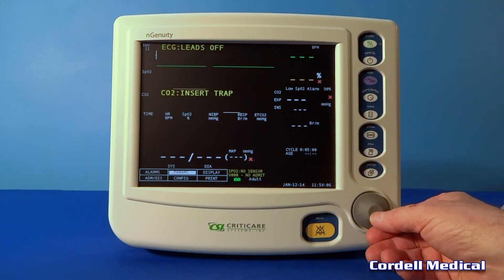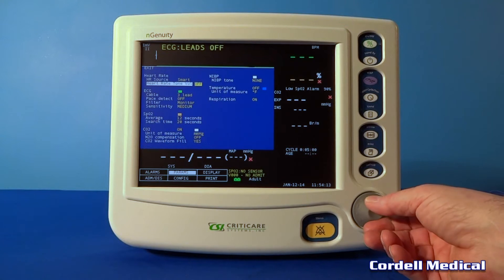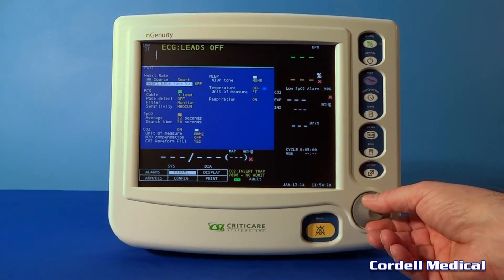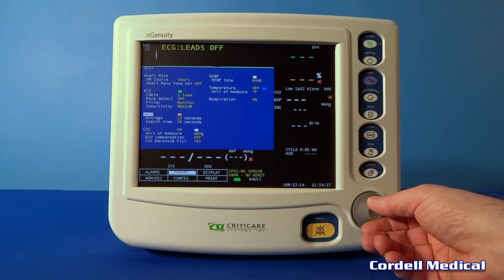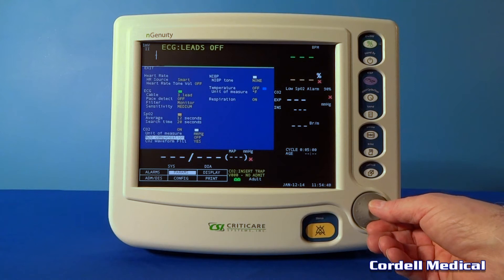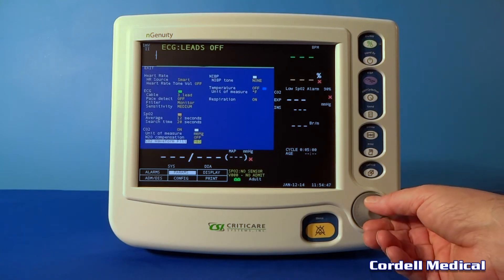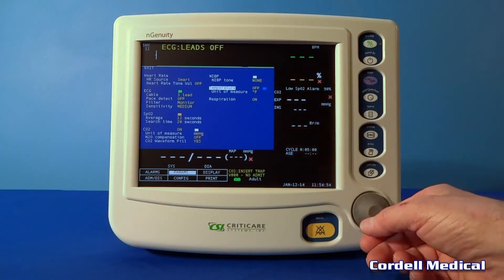Going on to params — here's where you would set all your parameters. This is setting your volumes, your heart rate volumes. You can set different colors for your different parameters. There are different settings for the measurement of CO2, including N2O compensation if you need that. Usually have the blood pressure tone turned off.